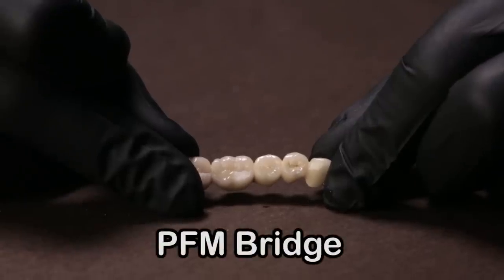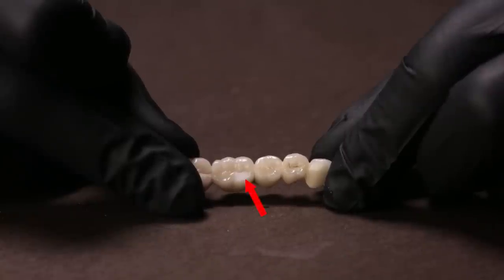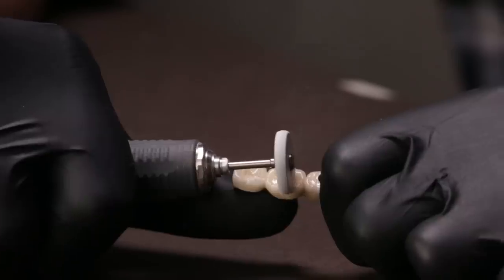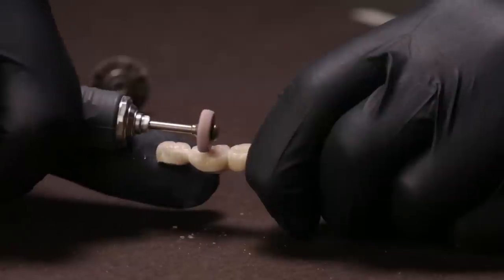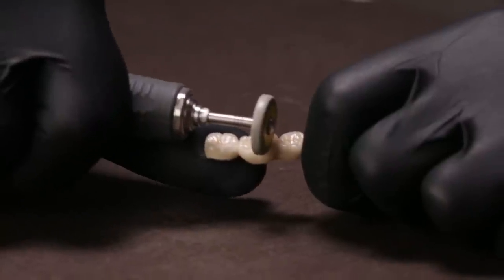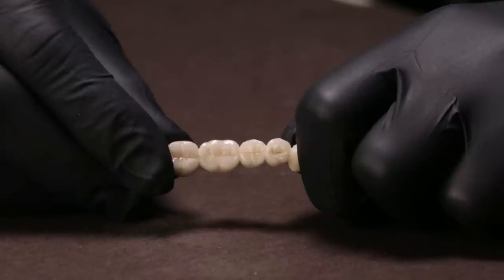You can appreciate how smooth the surface has become — I can now rest assured and cement my bridge. I can also use these wheels for a PFM restoration in a similar way. You can see the rough spot where the bridge was adjusted, and I follow the same steps: after dipping it in water, use the white wheel first, followed by the pink wheel, and finally the yellow wheel to impart a finished, smooth and polished surface before cementation.